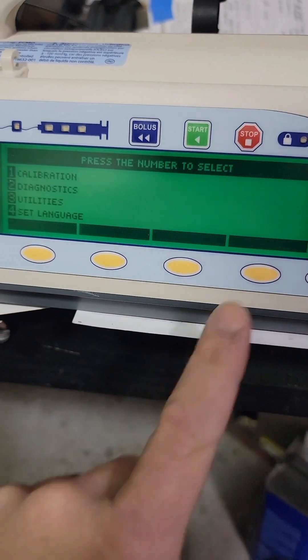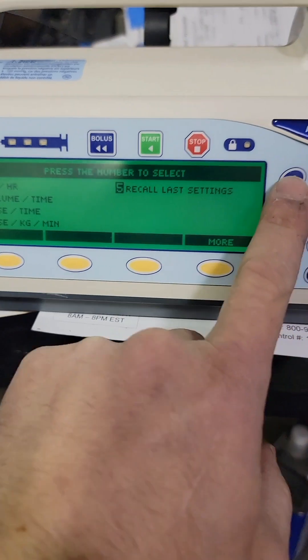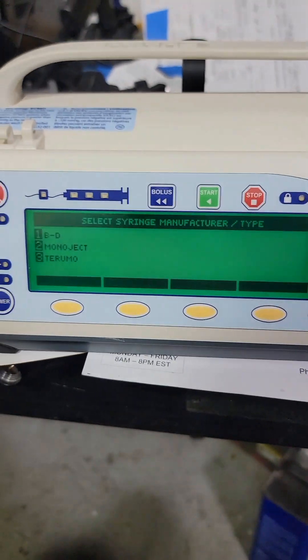Save changes, yes. If you want to see what the options are on your unit — Becton Dickinson, Mono Eject, Terumo — that's it, all you can use in here. That's what's in our library.